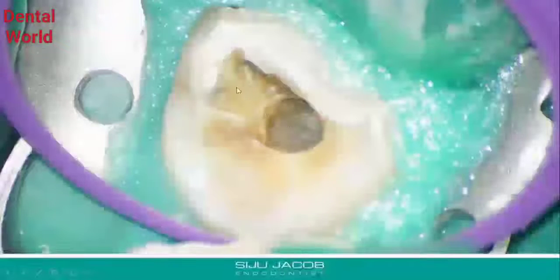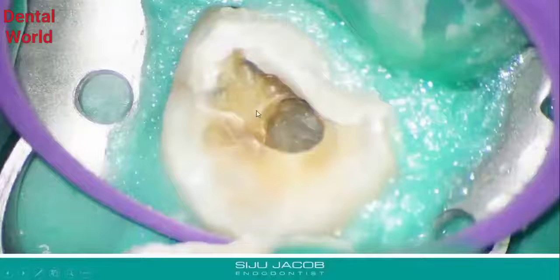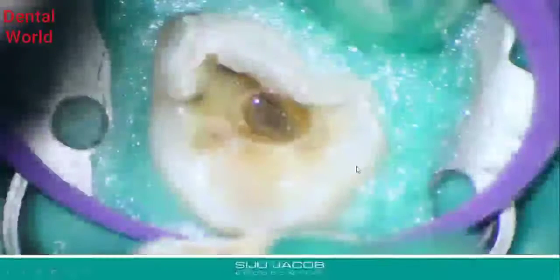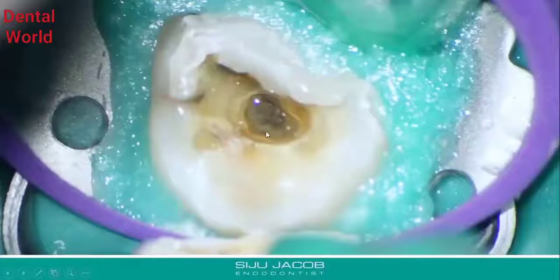What do we see on the buccal aspect? On the buccal aspect, we find that it's not so conclusive because the tooth structure is slightly less than the palatal, and I'm not really sure whether it's safe to drill here or not. We don't have that many clues at this point in time. Then, as always, what I do is I fill this existing cavity with water, and then I get a macroscopic perspective of the whole tooth. What I see is that the cavity is fairly middle, and there's quite a bit of tooth structure both palatally as well as buccally.